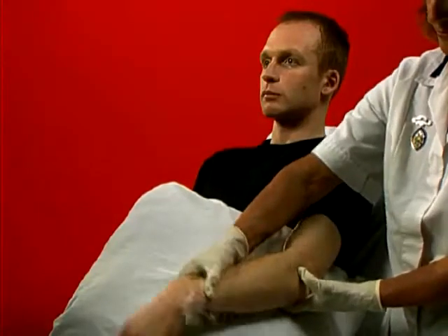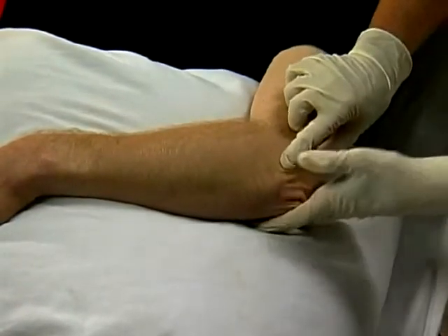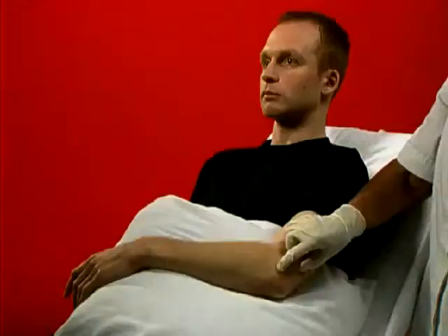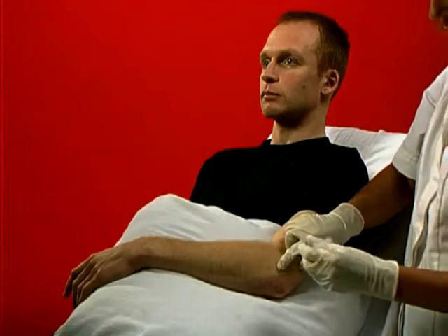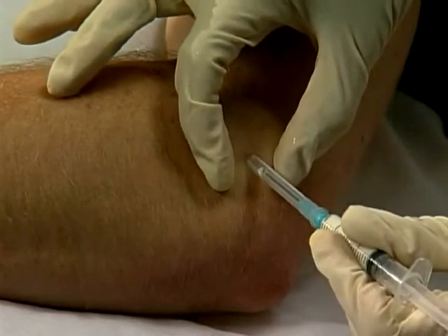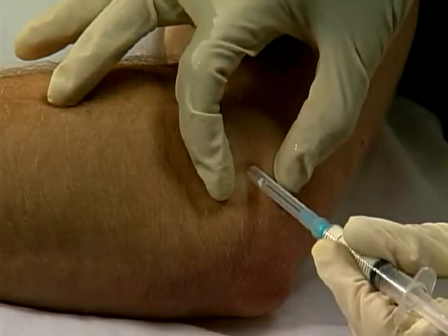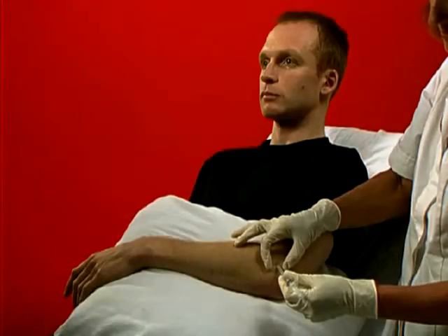Find the elbow joint line by feeling for a crease between the head of the radius and the humerus, and then flex elbow to about 45 degrees. Mark entry point, clean and firmly stretch skin, and rapidly insert needle perpendicularly just above the head of the radius. Aspirate and inject as a bolus.